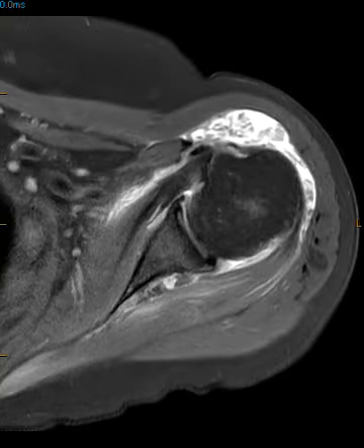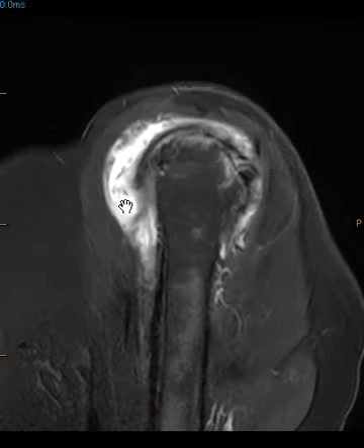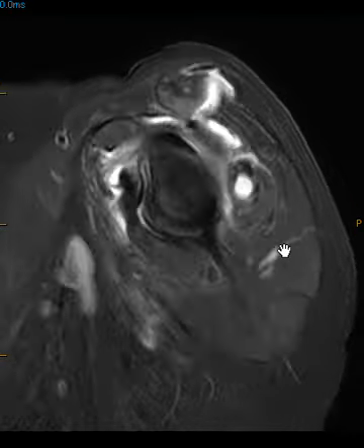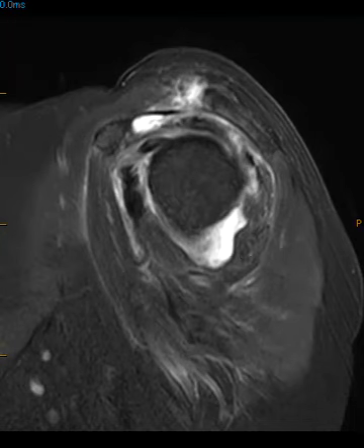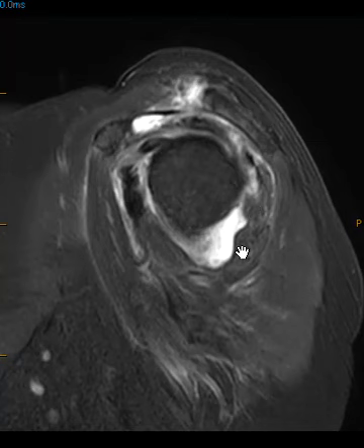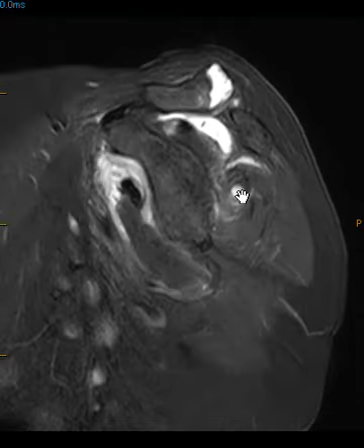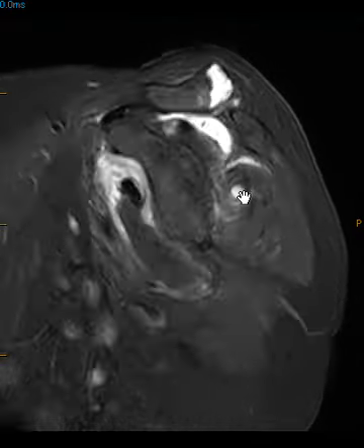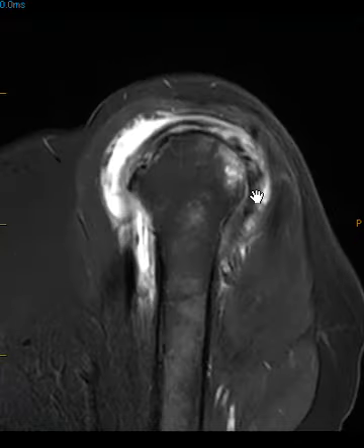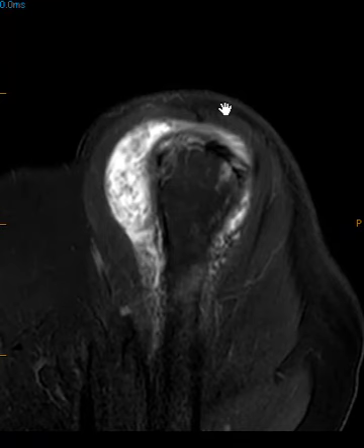Fortunately, the biceps tendon itself is not ruptured. One more view of this big bursal effusion with prominent bursitis, a thin rotator cuff, and that teres minor with significant fatty atrophy — extremely difficult to appreciate on any sequence other than the coronal images. This is also that interstitial tear within the infraspinatus, with that round fluid collection tracking between the longitudinal fibers. Just a complicated case with lots of findings, but the main takeaway is a great example of rice bodies. Thank you very much.